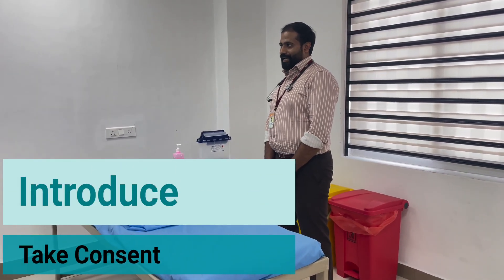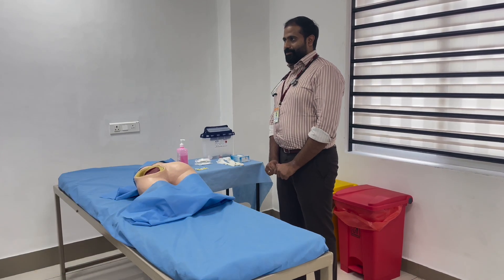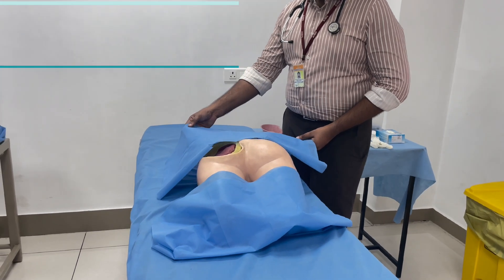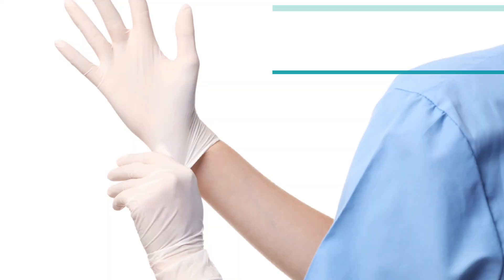Introduce yourself to the patient, take a verbal consent, and briefly explain the procedure to the patient. Position the patient adequately and expose the injection site. Don a fresh pair of gloves.